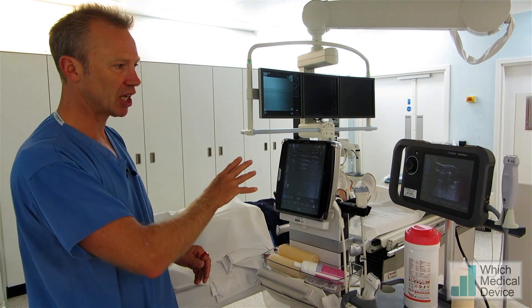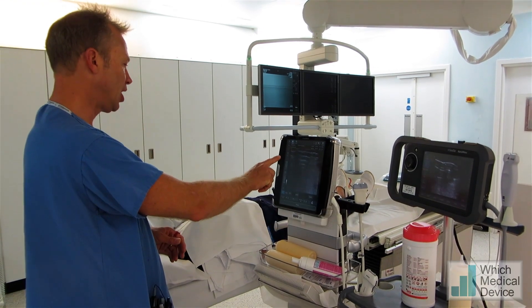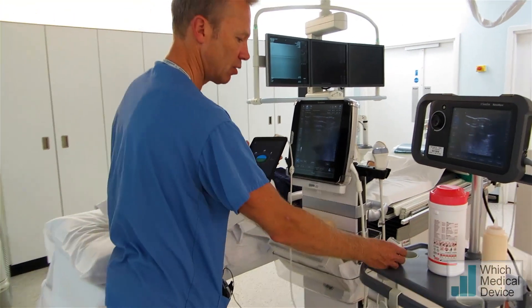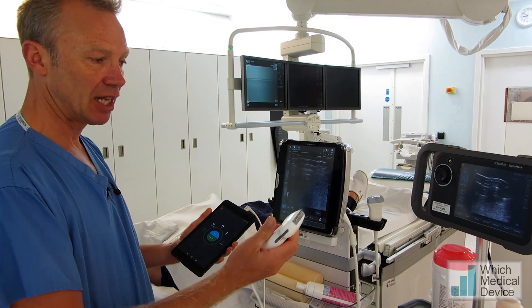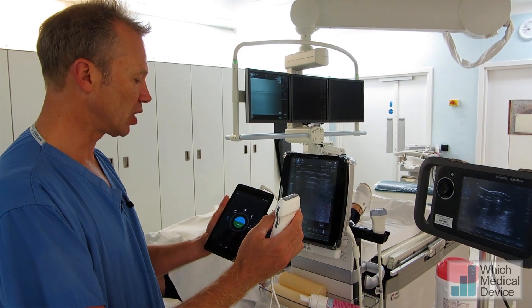What we've got here is three different portable ultrasound machines. We've got the SonoSite NanoMaxx, we've got the GE Healthcare Venue 50, and we've got this new edition which is the Philips Lumify, which is essentially an Android tablet or an Android phone with two different probes — a linear probe and a curvilinear probe. I'm just going to do a quick comparison between them all.